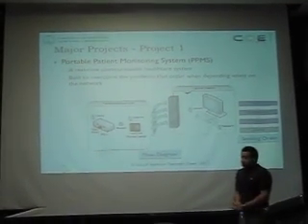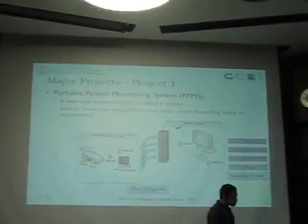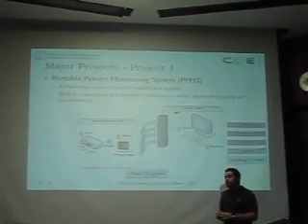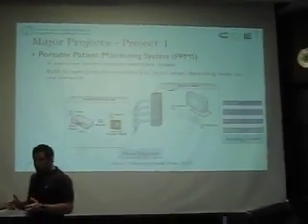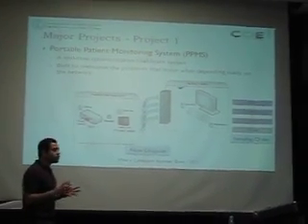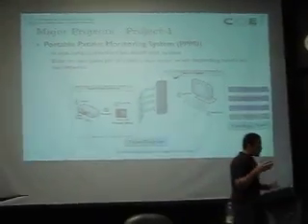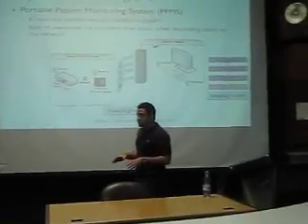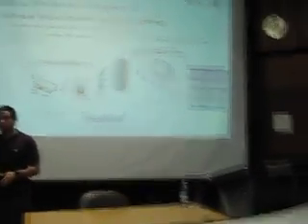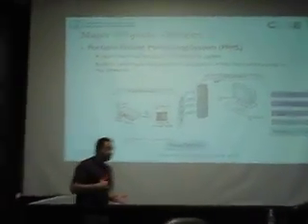Well, the first project I'm going to talk about is the portable patient monitoring system. It fulfills an objective that we don't want to depend only on the network of the healthcare organizations. This is a real-time healthcare system that solves the problems when failure happens to a router or a switch in the network of the healthcare organization, like a hospital, of course.